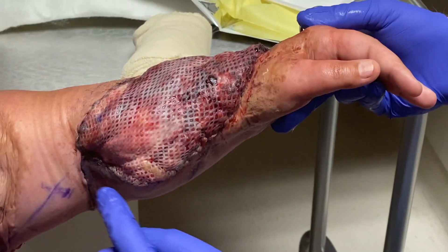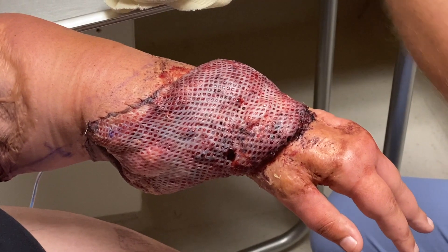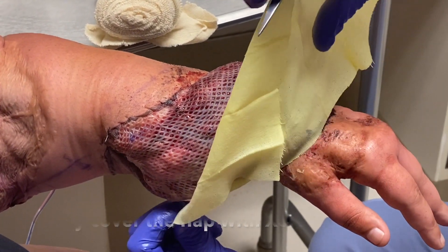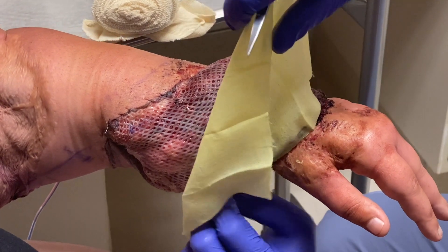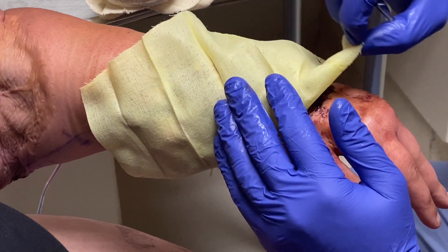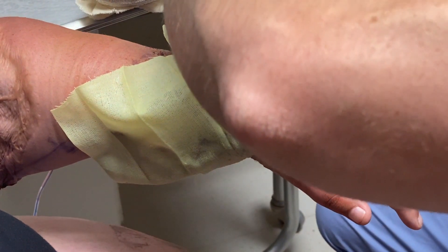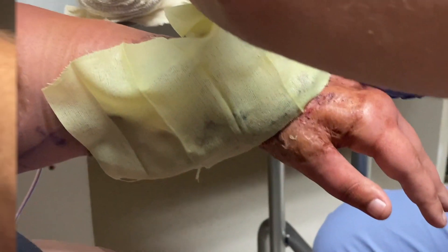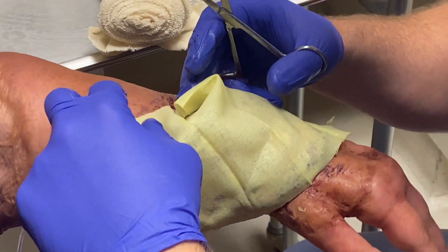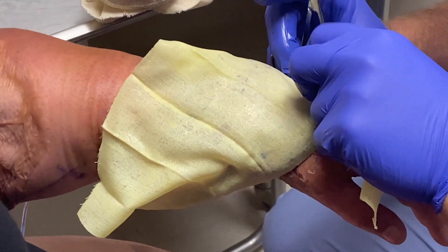This side of the skin flap is cut right there. So this is literally just fat and fascia. When I do this, I'll make sure I measure out exactly how much is needed for the flap. I'm not putting any on the regular skin — I want it all isolated to the actual flap. The reason you avoid putting it on the regular skin is it can macerate it and end up extending the wound farther than you want.